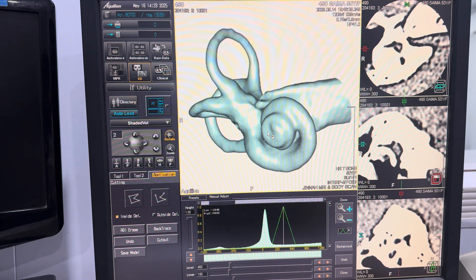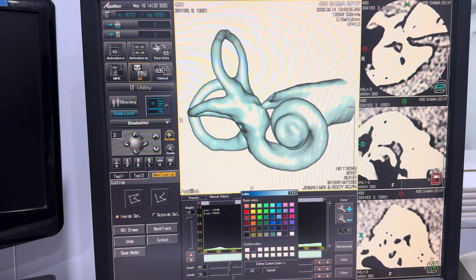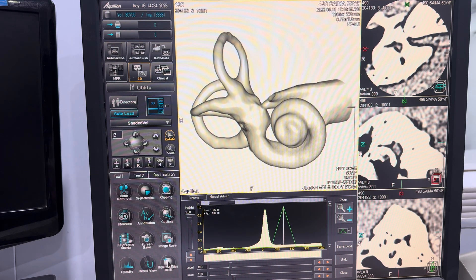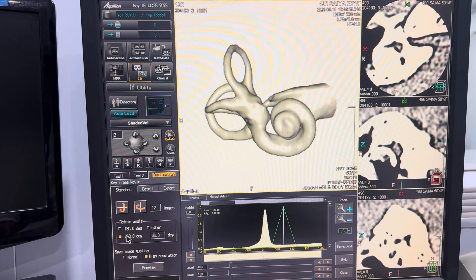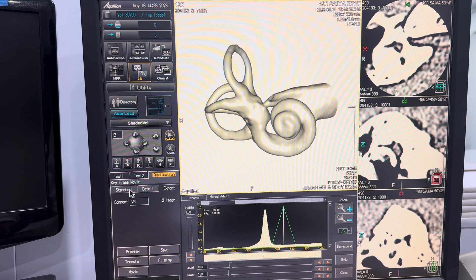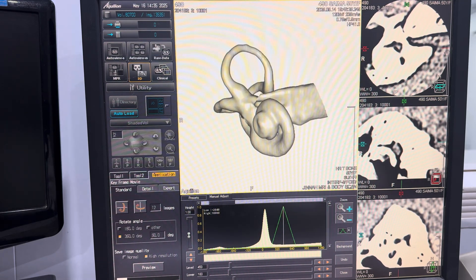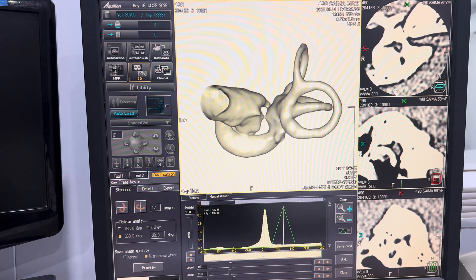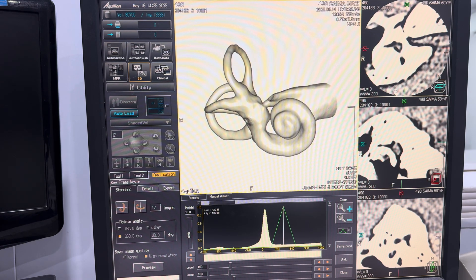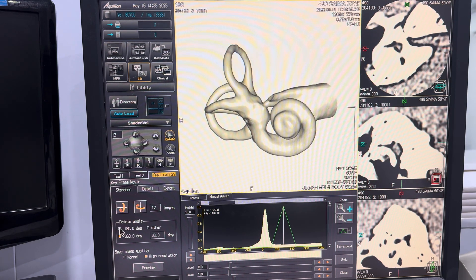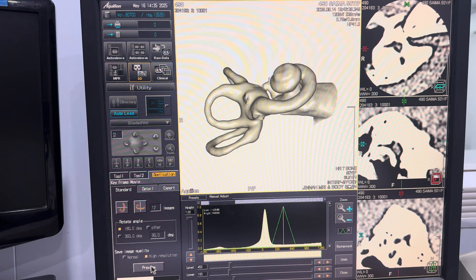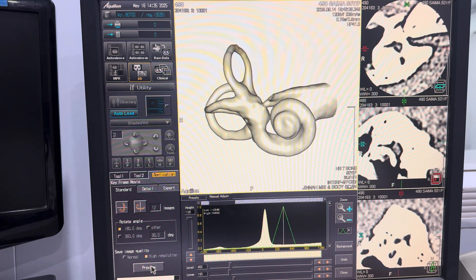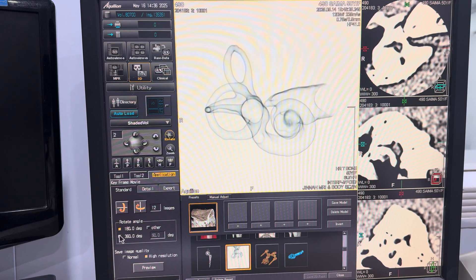Next, we will perform a 360-degree horizontal rotation of the 3D model, allowing for a comprehensive view of the reconstruction from all sides. This rotation helps in assessing the quality, detail, and accuracy of the rendered anatomy. Following this, the model will also be rotated vertically from top to bottom at a full 360 degrees. By rotating the model along both horizontal and vertical axes, we achieve a complete multi-angle visualization, enabling a thorough and detailed anatomical assessment.